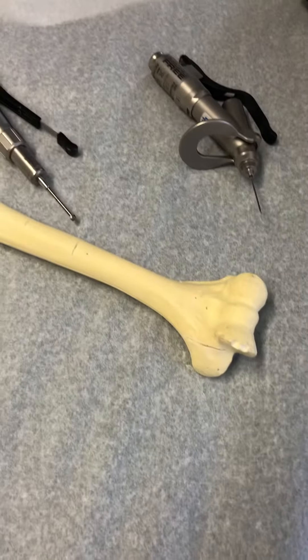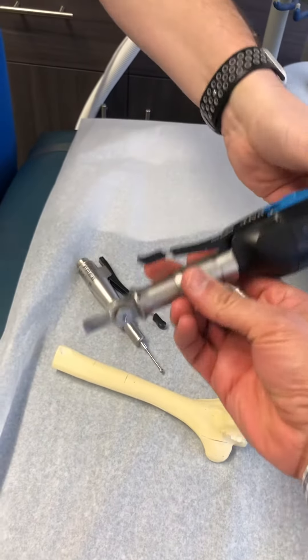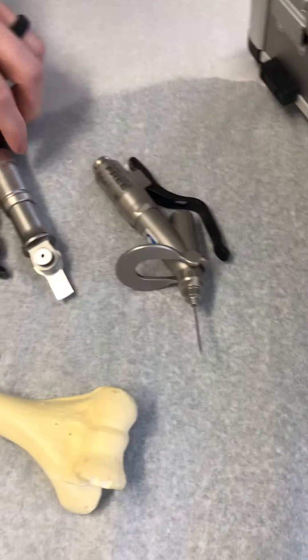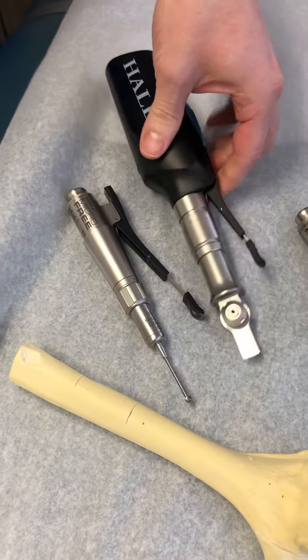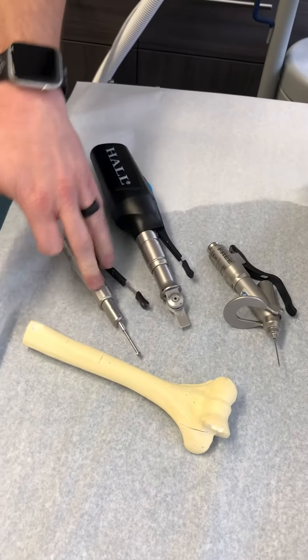And folks, that wasn't a real bone by the way — that's actually just a model, a bone model. So once again, what kind of attachments do you have? You have the saw? Yeah, so reciprocating saw, oscillating saw, sagittal saw, pin and wire driver, and your high speed and medium speed drill — so everything that currently exists today.